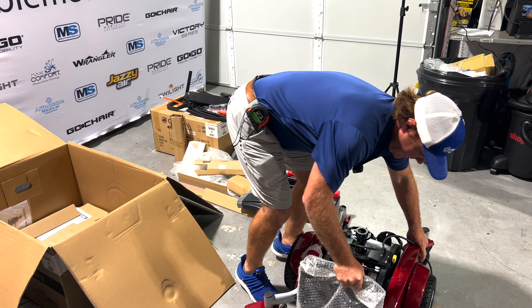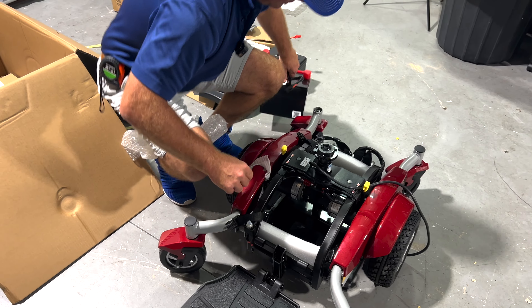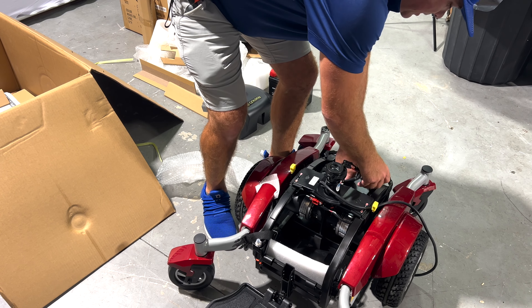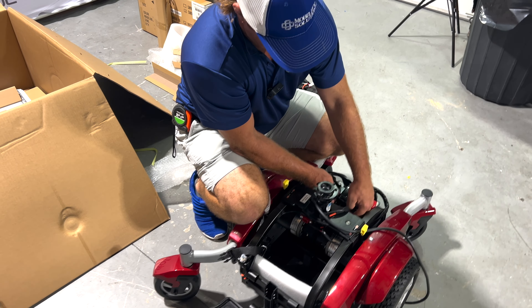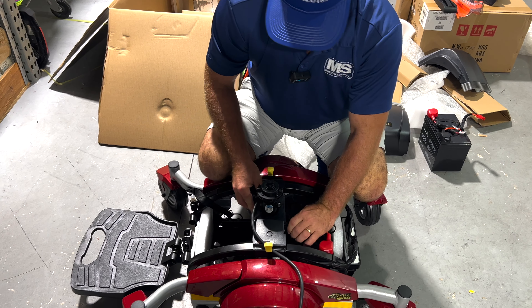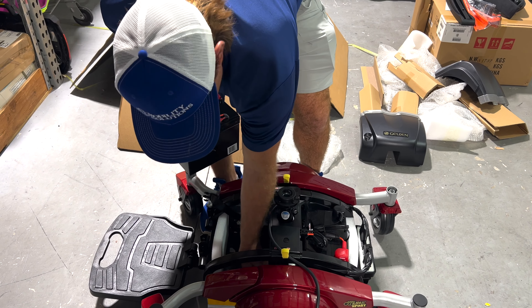I've already seen changes that they made that I'm excited about — bigger footplate, adjustable footplate. So now that we've got it out, you've got to put your batteries back in here. If you left the batteries out and rolled it out the front, just make sure you still have to take those shrouds off. And you've got to plug your batteries in. Most companies are going to send their units with the batteries unplugged, which is going to be better for the batteries so they don't discharge.